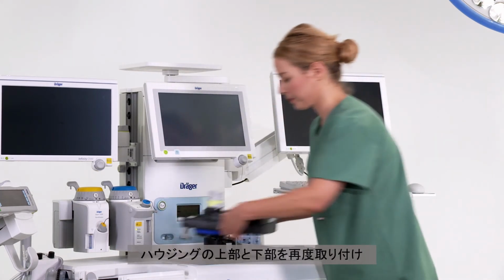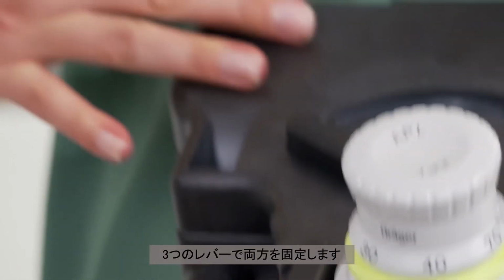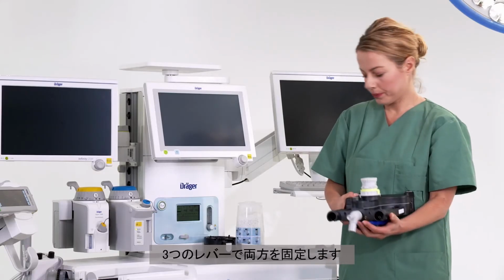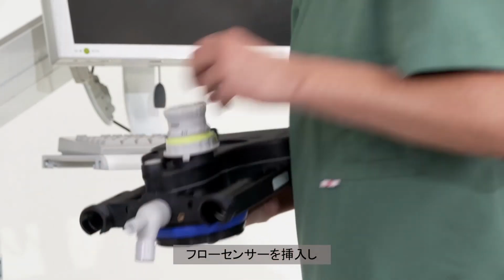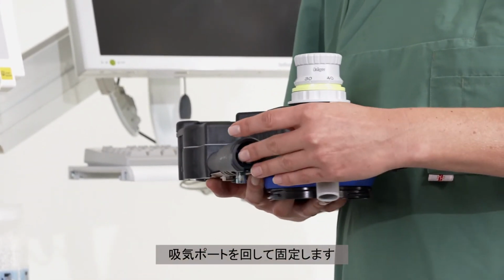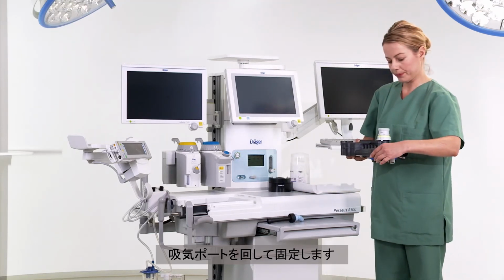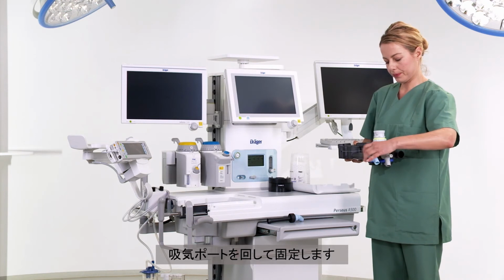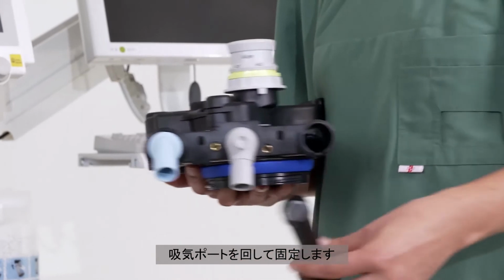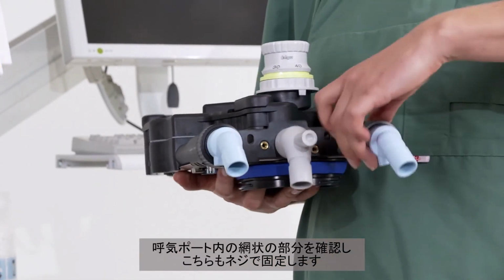Reassemble the upper and lower part of the housing and lock both parts using the 3 levers. Insert the flow sensor and screw on the inspiratory port. Check the flow grill in the expiratory port and screw it on as well.